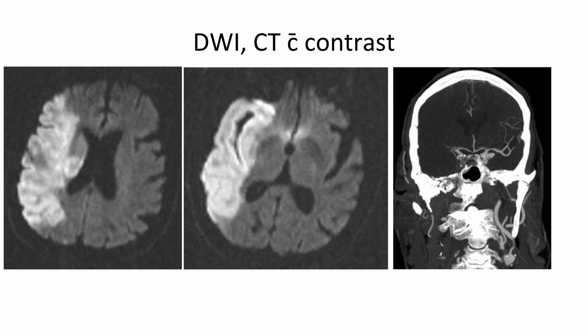Now, if we take that same patient, a little while later, we find out that unfortunately something has gone very wrong. So here we can see what looks like a very low resolution image. There's no bone around it though, it's only the brain, and it's showing us this bright intensity. This is a classic diffusion weighted image. So this is MRI, but the diffusion weighted image is averaged over time, and so it looks lower resolution.